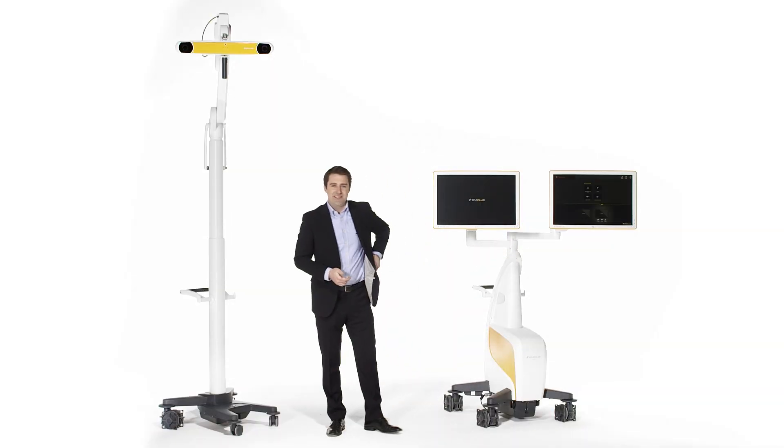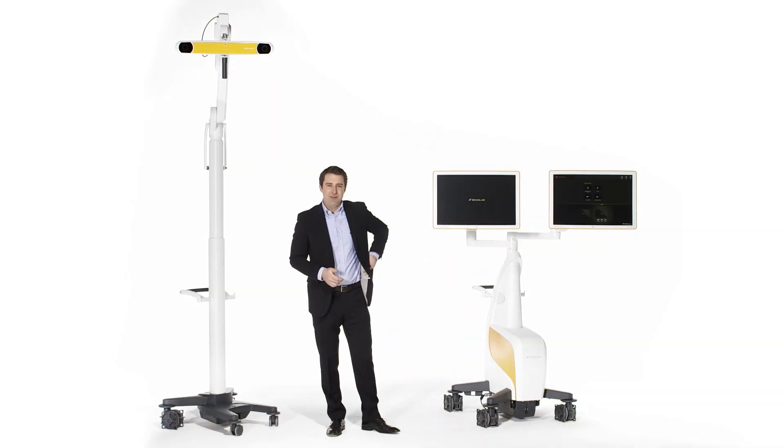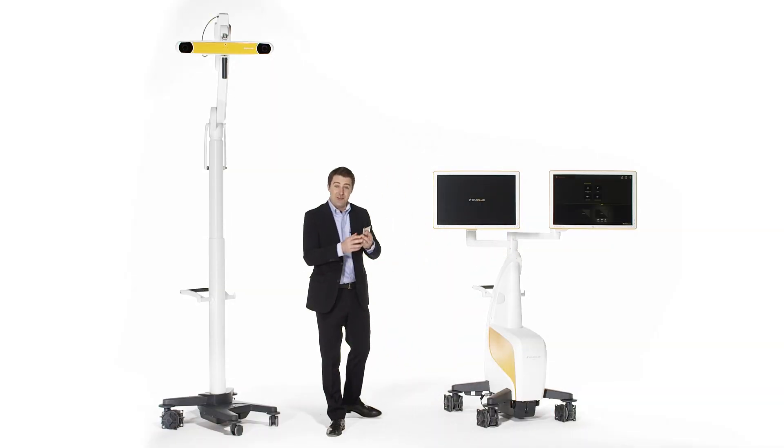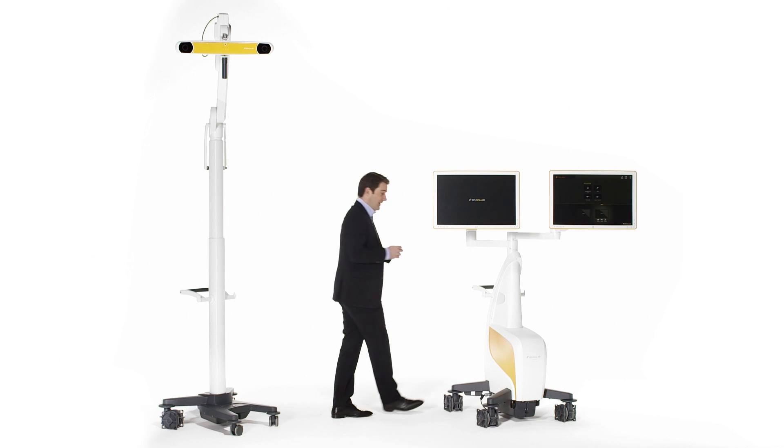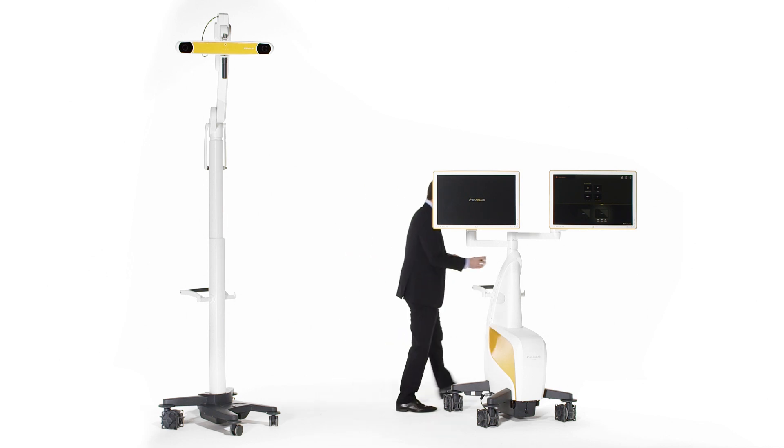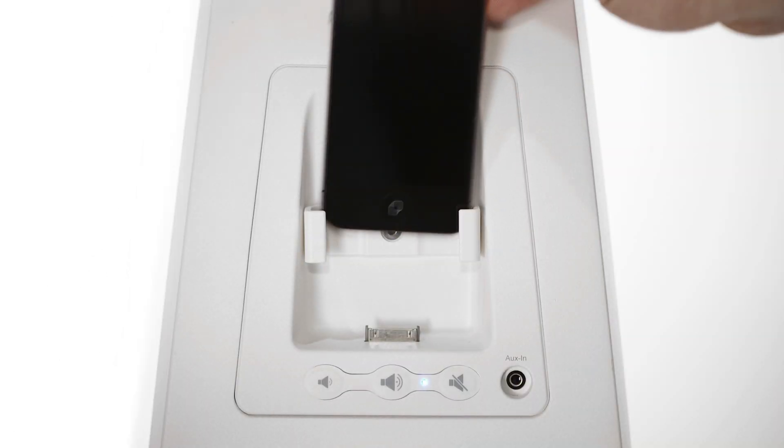Curve offers a built-in high-fidelity music dock, which allows the OR team to navigate to their own soundtrack.